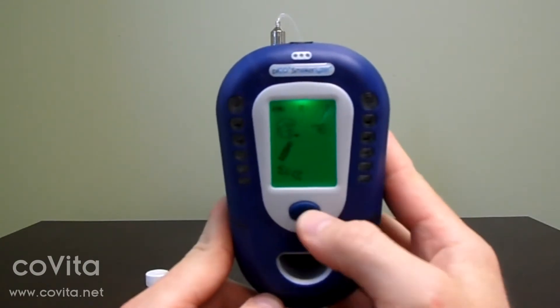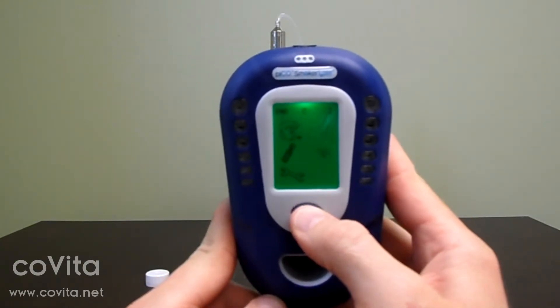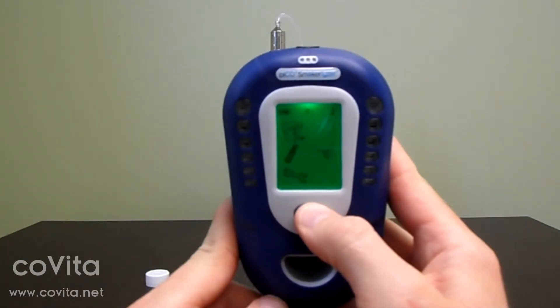Once on the home screen, single-click the scroll down to the can of gas. Double-click to select the can of gas.